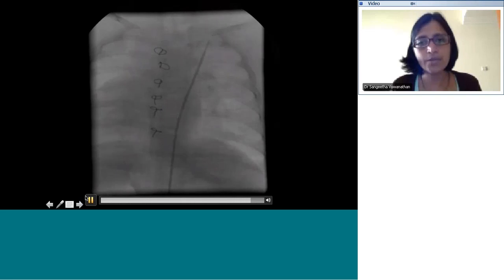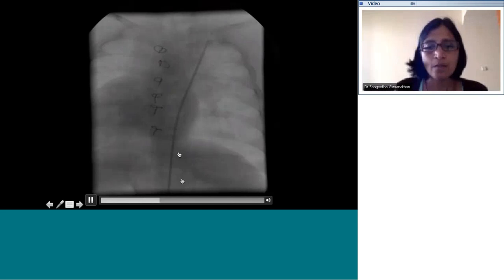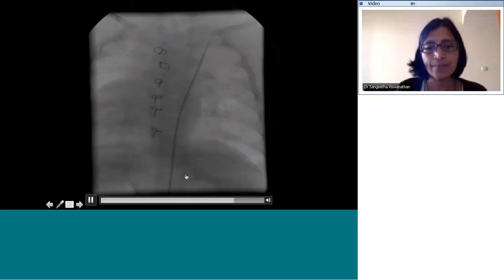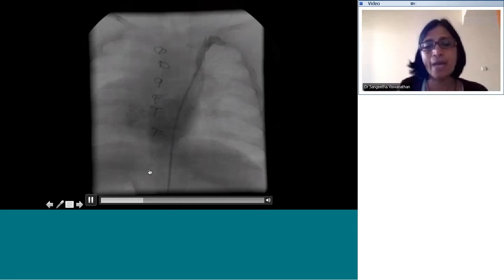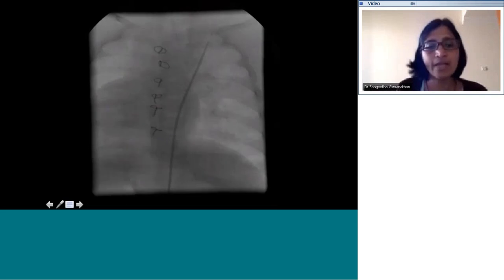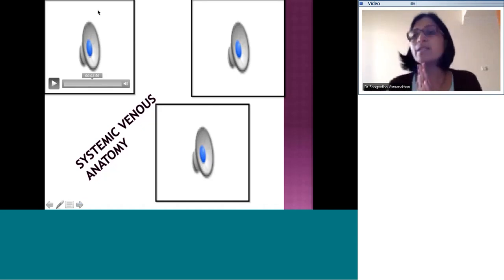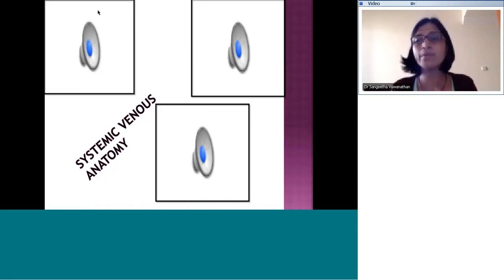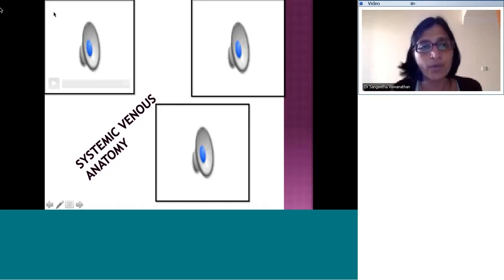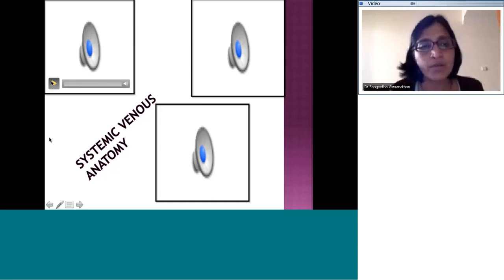This next angiogram: what is the position of the catheter with reference to the spine? It appears to be in a midline position, and the liver appears to span across the abdomen. So this is a patient with situs ambiguous — dextrocardia and situs ambiguous. For situs estimation, the best view is a plain frontal or posterior-anterior view. We looked at three patients all with dextrocardia: one had situs solitus, one had inversus, and one had situs ambiguous.